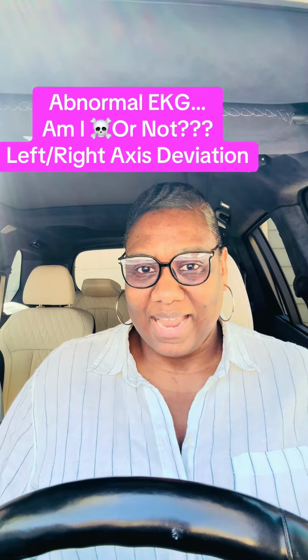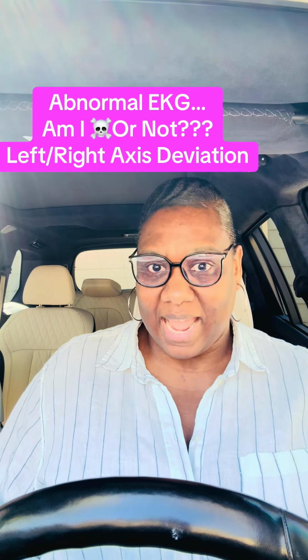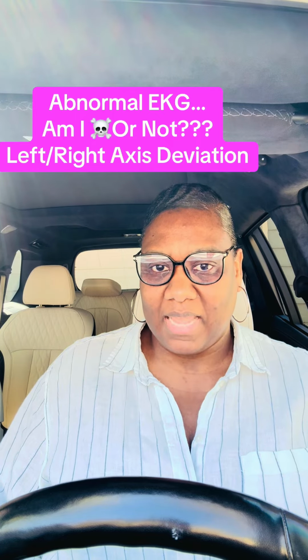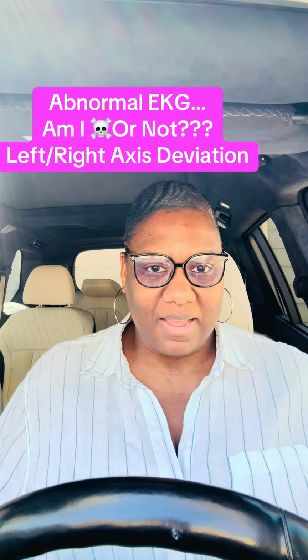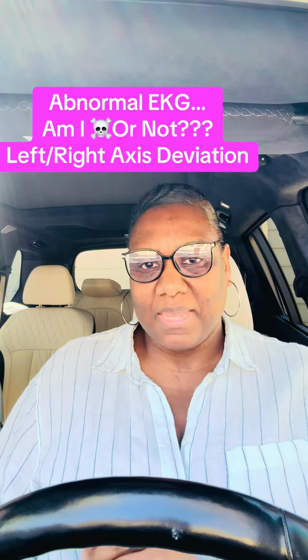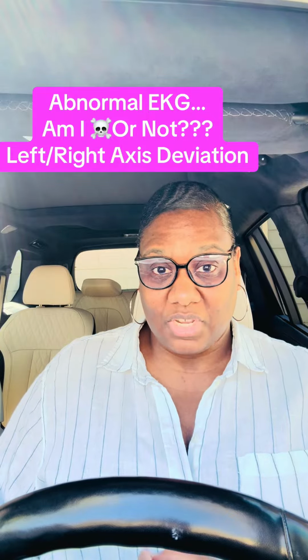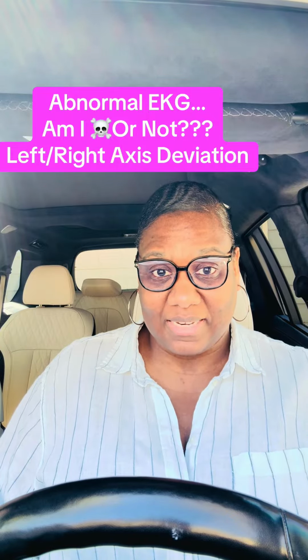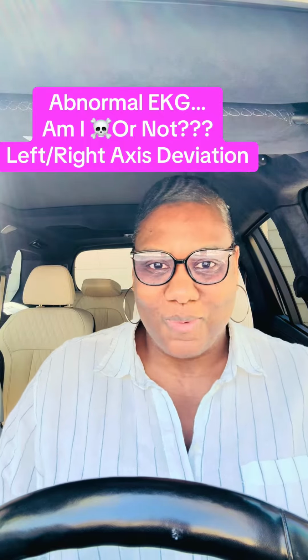Left or right axis deviation with symptoms, now you got a picture that's being painted clinically that deserves further investigation. Maybe an underlying lung issue when it comes to right axis deviation, maybe an underlying coronary artery blockage issue when it comes to left axis deviation. Does that clear things up? I told y'all you're gonna want this information.